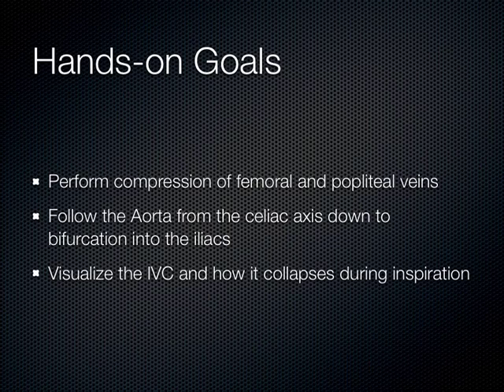Use it as a free scanning session to tighten up wherever else you have questions, heart, whatever it is you want to do. But really today, it's the DVT, aorta, and IVC.